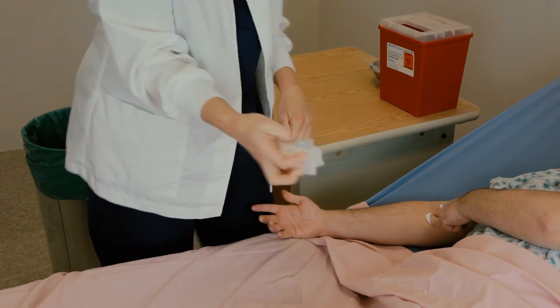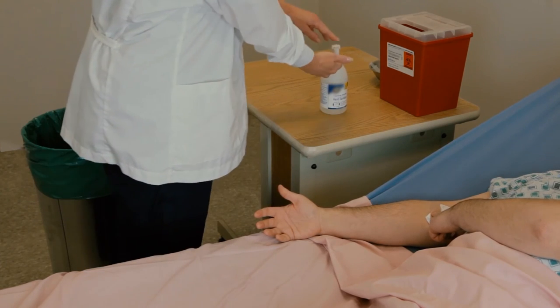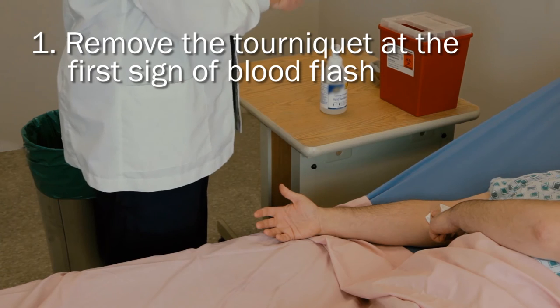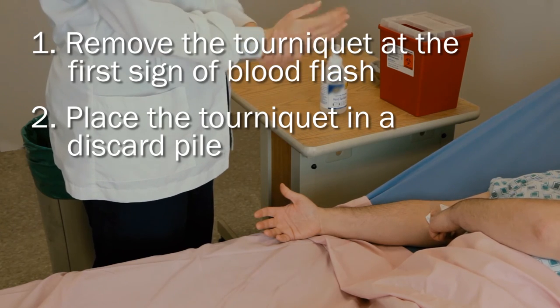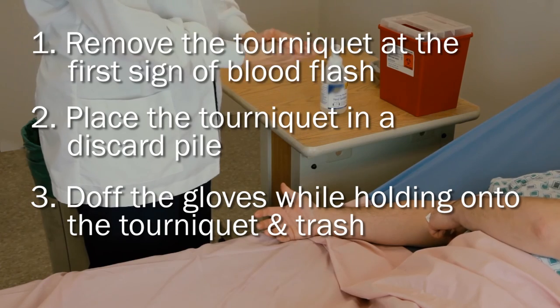You can reduce the likelihood of accidentally leaving a tourniquet on a patient's extremity if you: one, remove the tourniquet at the first sign of blood flash; two, place the tourniquet in a discard pile to provide a visual cue for the caregiver and patient; and three, doff the gloves while holding on to the tourniquet and trash.